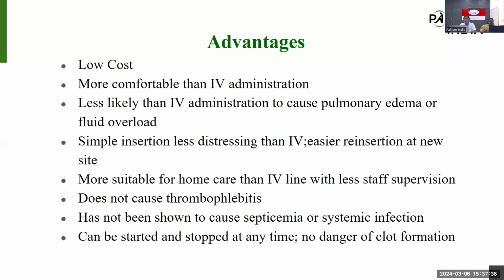Okay. The main advantages include that it is low cost. In our settings, we are usually using scalp vein sets or butterfly needles for subcutaneous infusions, and some institutions are using IV cannulas for subcutaneous infusion also. It is very low cost and more comfortable than IV administration. We know in IV administration, we need a patent IV line, but here we don't need a patent IV line. If the subcutaneous sites are intact, we can administer subcutaneous fluid for that patient.